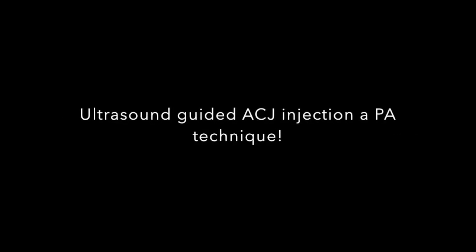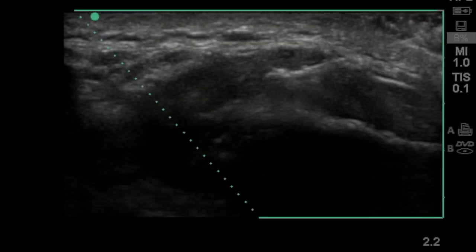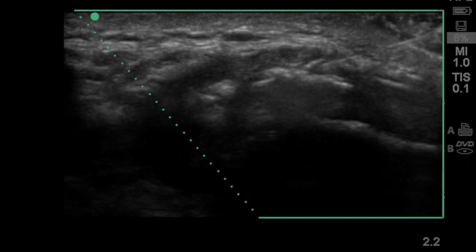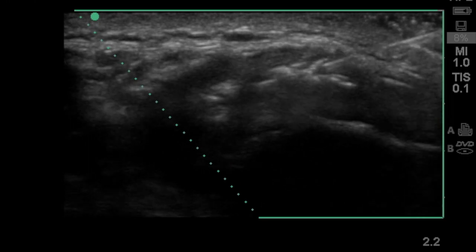Hi everyone, we just wanted to release this brief video tutorial on how to perform an ultrasound guided injection from a posterior to anterior approach. We've been using this in our practice when it's been difficult to access the AC joint from a more lateral approach, which is the more traditional injection technique utilized in clinical practice.